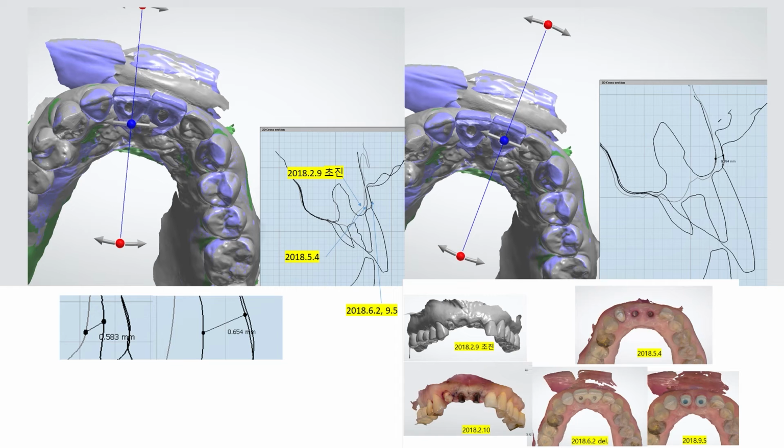And for number 21, the stock abutment doesn't really result in much change, but with the screw type temporary, here we can also observe an increase in buccal volume. And also, at the final abutment level scanned in number 11 and 21, the buccal volume is maintained.